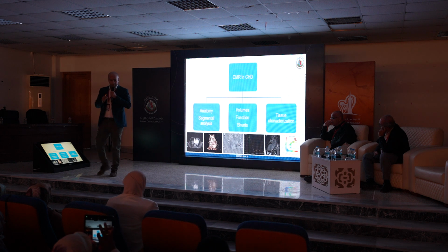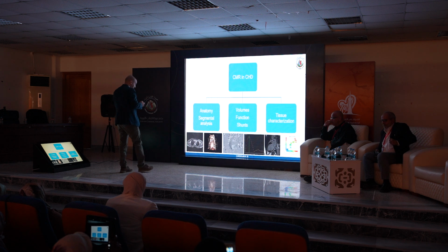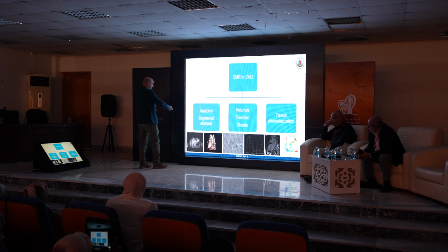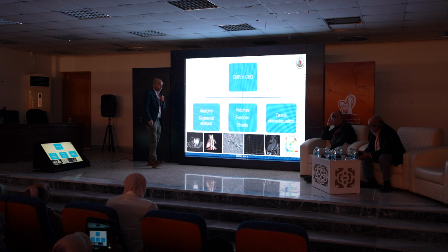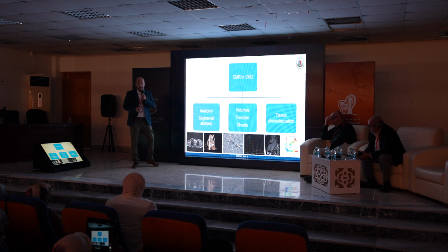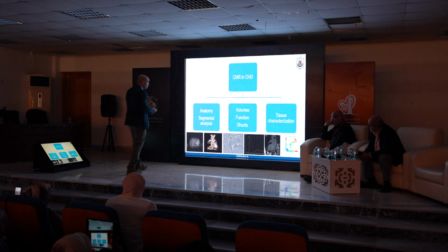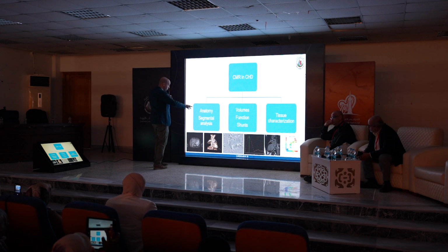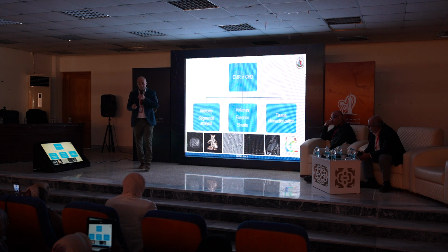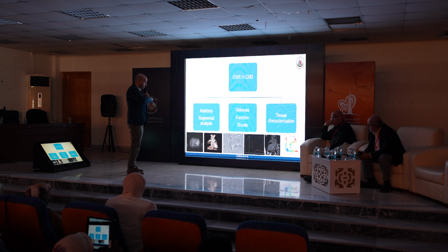Now we go for cardiac MR in congenital heart defect or congenital heart disease. We'll use it first for anatomy and segmental analysis, like these sequences. We can use it to get a 3D or a volume for the whole heart. We use it for assessment of volume, functions, assessment of shunts, and measurement of QP, QS. And lastly, you can use it for tissue characterization in cases of infiltration or masses.